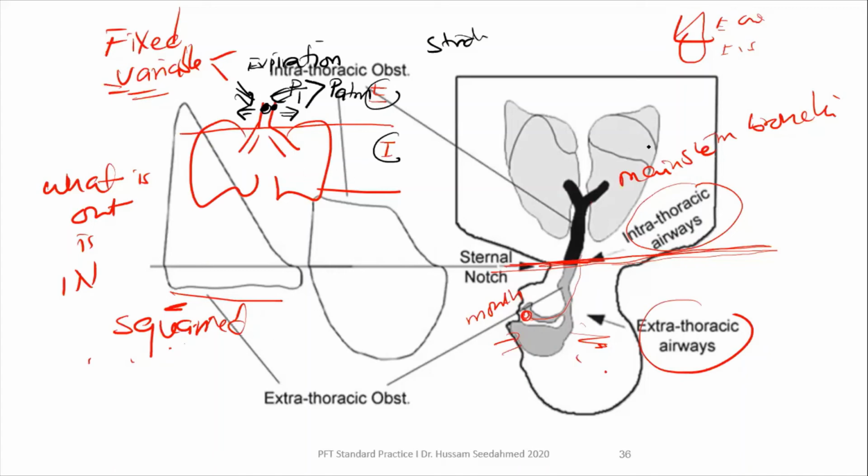On the other hand, if we take intrathoracic, we said intrathoracic will affect expiration. In the same way, now this is my airway, and the lesion is here.